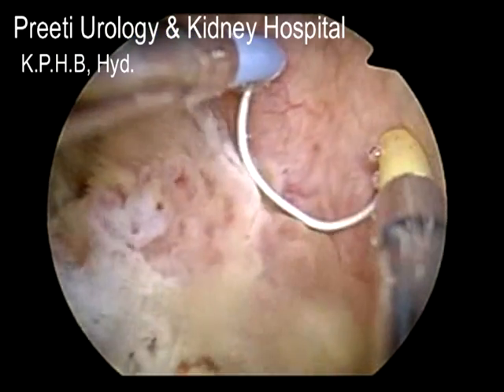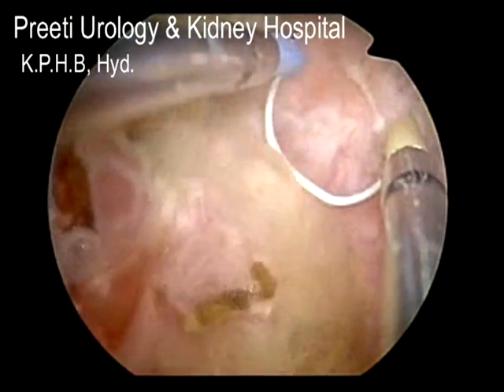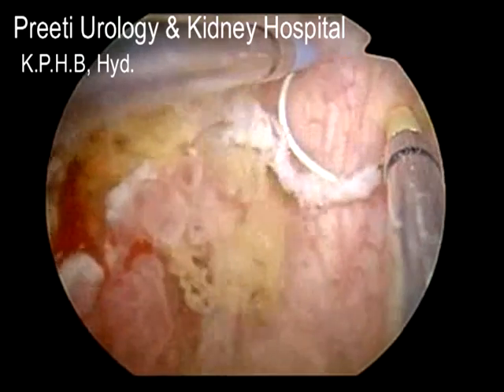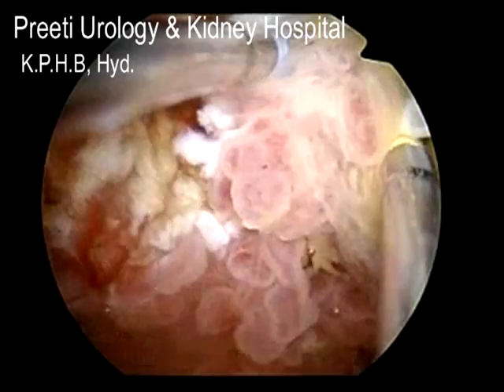So you have to see the edge of the bladder wall, and from the edge we have to remove the tumor completely. Slowly from the edge, whenever we are removing the bladder tumor, it should be in a collapsed state so that the bladder will not get perforated. You have to remove the entire tumor carefully, and at the end you have to do coagulation. In between, if bleeding is coming, it is difficult to coagulate. You have to remove these fragments intermittently, otherwise they will stick.